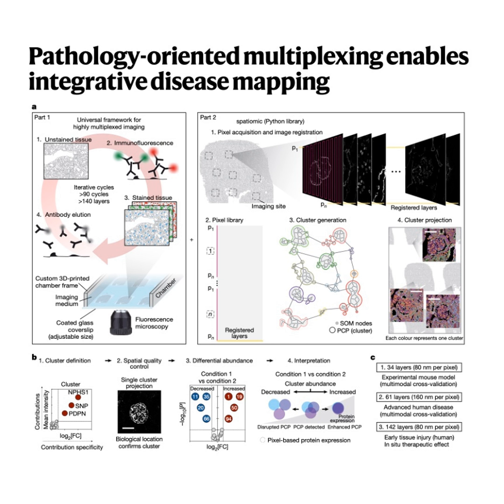So seeing AIFM1 and TRPC6 co-localizing right there at the pixel level suggests a specific mechanism. Calcium-mediated mitochondrial stress happening within those crucial tubular cells in DKD patients. That's incredibly specific. It connects the dots from the overall disease state right down to a potential molecular mechanism in a key cell type. Did these newly identified cluster signatures actually correlate with how well the patient's kidneys were functioning overall?